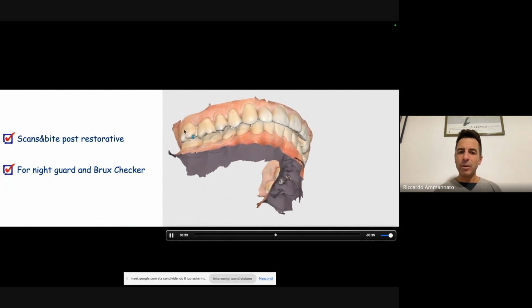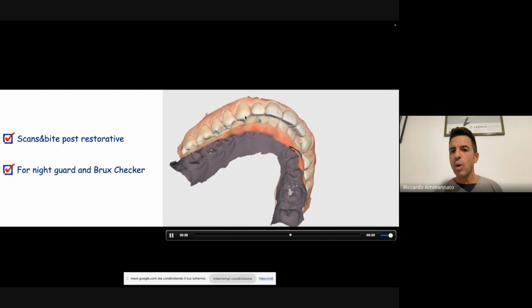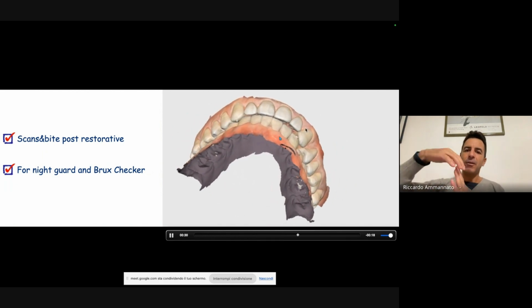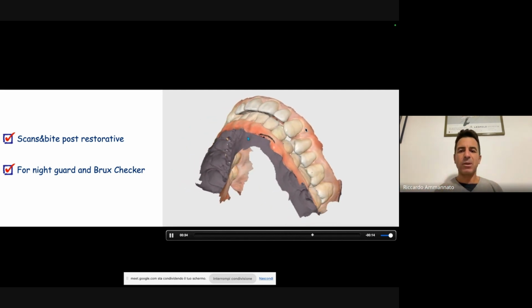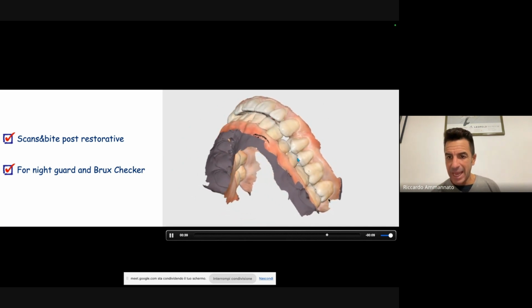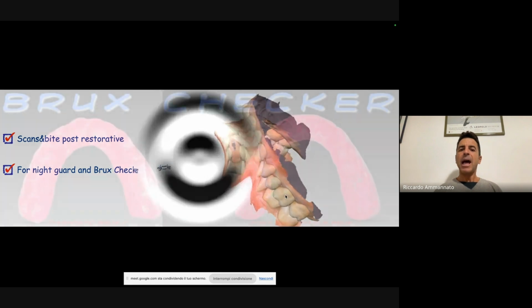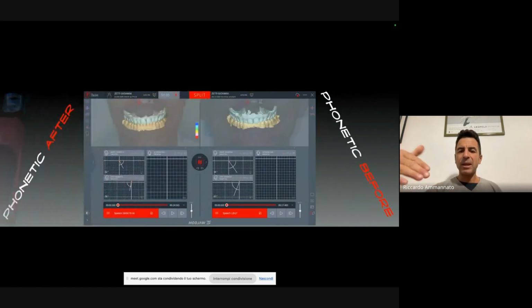And we see, again, we want a static from second molar to the canines, but I want to have clearance for my overjet in order not to lock my mandible, in order not to have constricted envelope of function. And again, from canine to second molar here. And on these scans, we will perform the post-op bruxchecker, and I'm not going to stop here, and the night guard.